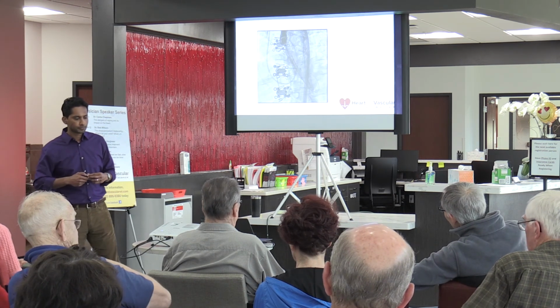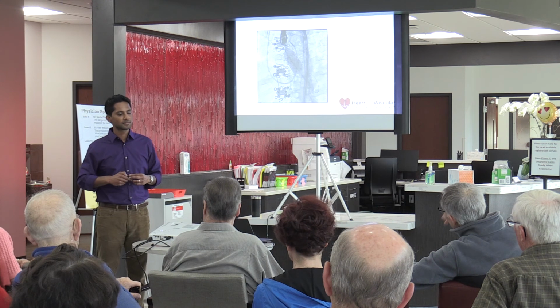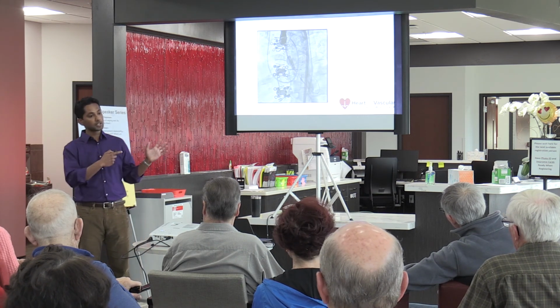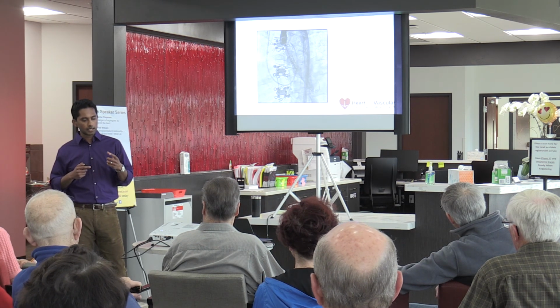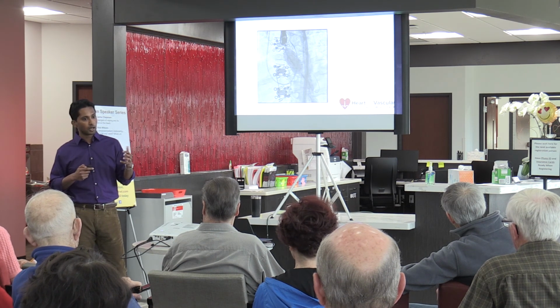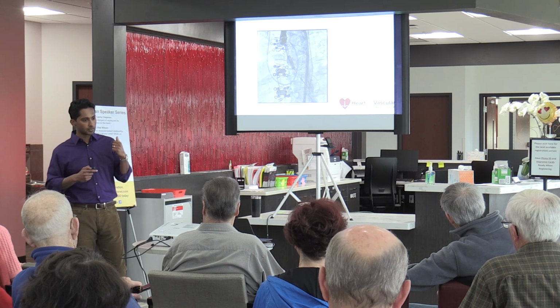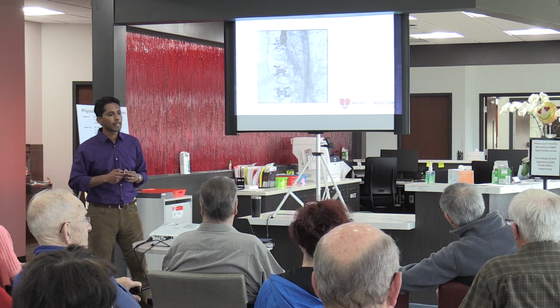Sure. If you have a metal valve that needs replacing, what are your only options? Surgery. Open surgery. Yes, sir. So that's kind of the rub. It presents a dilemma now, right? Now that you have this technology, when folks present with a valve problem, somebody that may have almost certainly gotten a mechanical valve in years past is now getting a bioprosthetic valve for this reason. Because it gives you the option to then put a minimally invasive TAVR valve into a bioprosthetic valve.